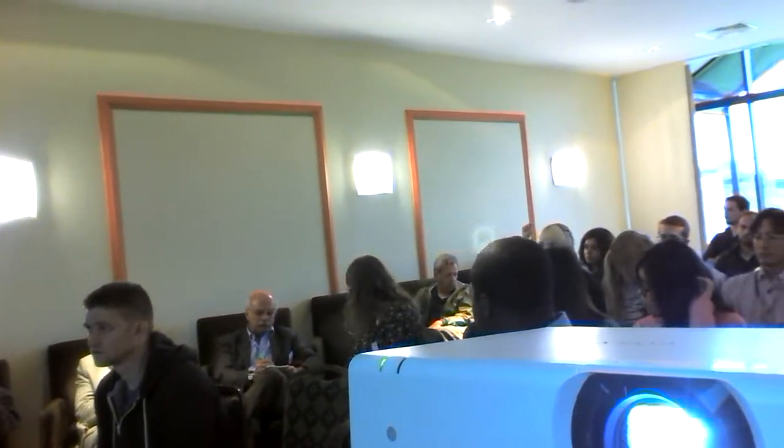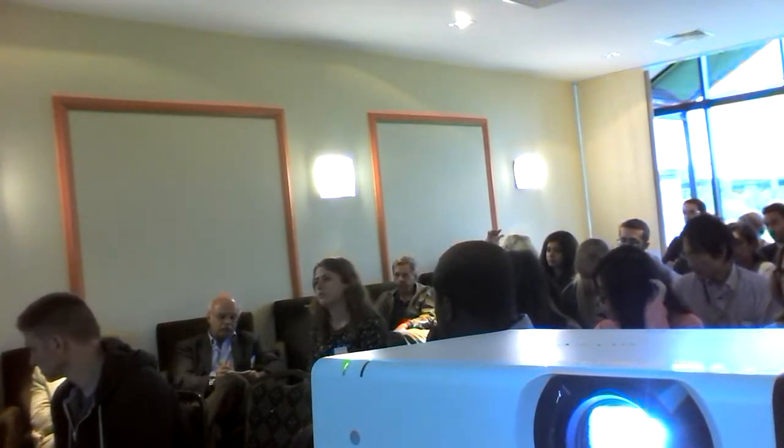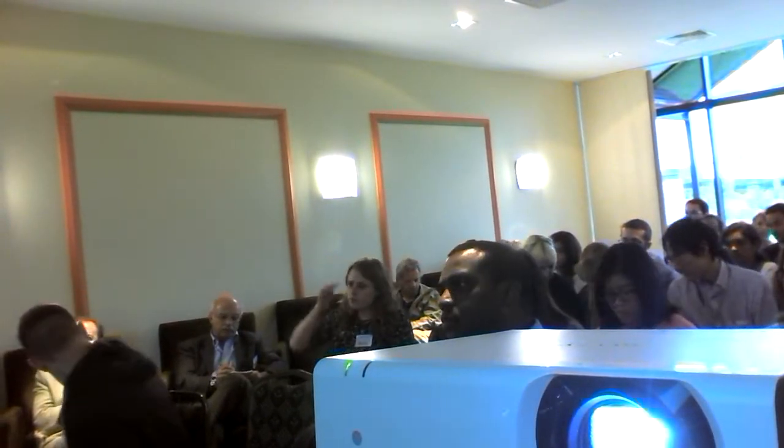Keisha, another question. David, how do you deal with artifacts due to fiber, scalp, or head variability in such a system? Because that must create some... Well, the coupling of the fiber to the head will introduce artifacts, absolutely. But with brain activation measurements, we're looking at changes. So we're looking at the fractional changes in the signal. It calibrates out all of the coupling issues for those measurements.